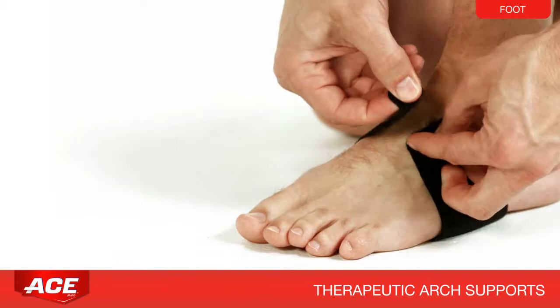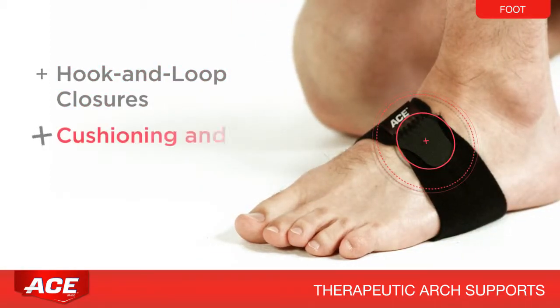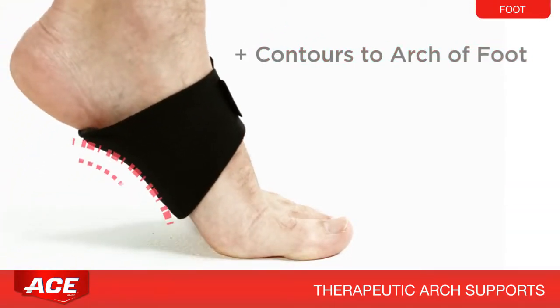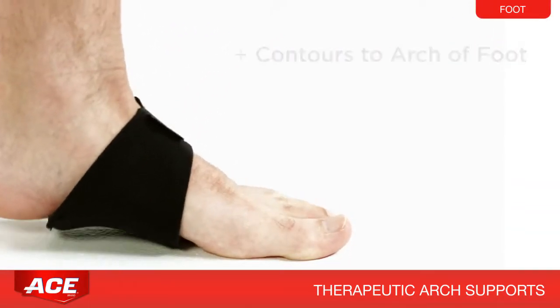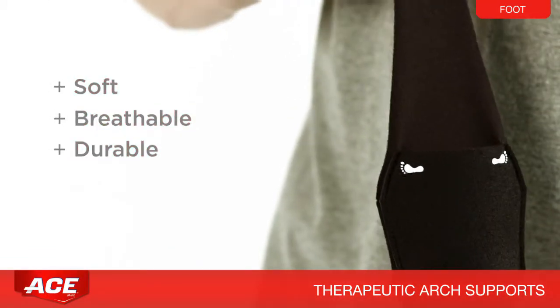Then wrap the support around each foot and secure it with the hook and loop closures to provide compression and a comfortable fit. Notice how the cushioned arch support conforms to the arch of the foot. Soft, breathable, and durable materials provide additional comfort.